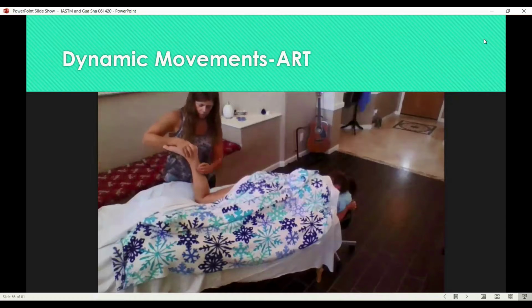The last one I was going to say that we did a little bit of the TFL and worked some of the vastus lateralis attachments while I was having the leg rotate in and out in internal and external rotation.